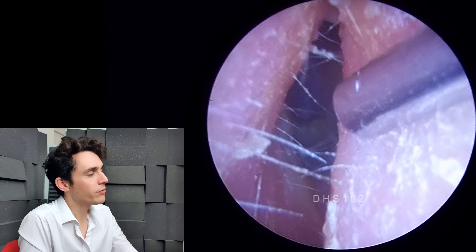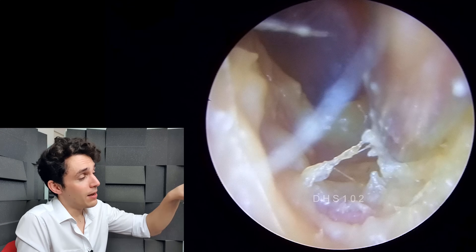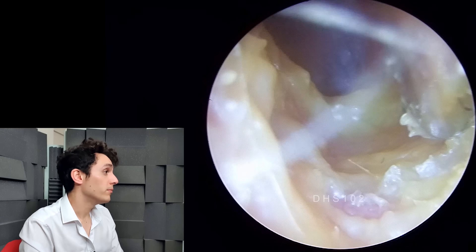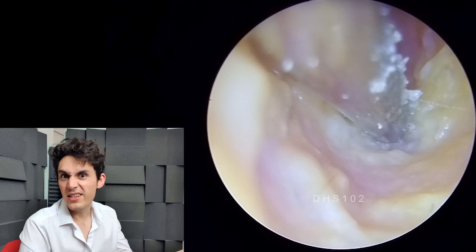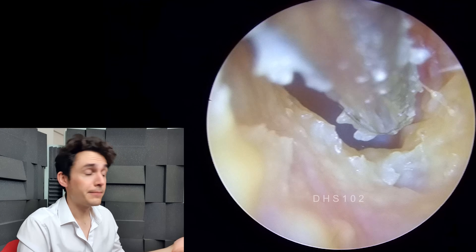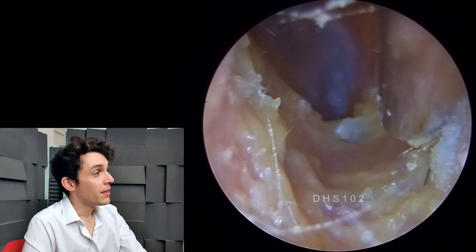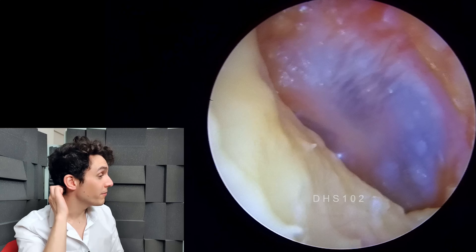Here you can see the ear canal is looking pretty clean already. We're not going to be able to get all of this wet dead skin out, because since it's infected the skin is very, very sensitive. We certainly don't want to be poking around in there, and we don't want to cause any bleeding or further cracks in the skin. This patient will then be in line for drops — she'll take some acetic acid drops, which is diluted vinegar essentially. We'll also get her GP to prescribe further drops containing acetic acid, a steroid, and an antibiotic, which is the usual cocktail of medicine for a patient like this. The most important thing is that the ear is clear of most debris, because if your ear is filled with dead skin, the medicine will not have a good effect.